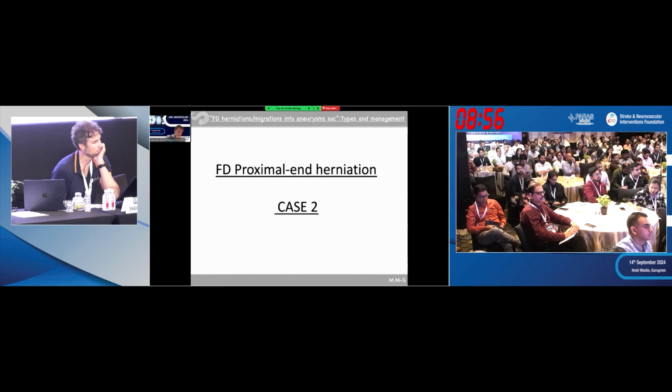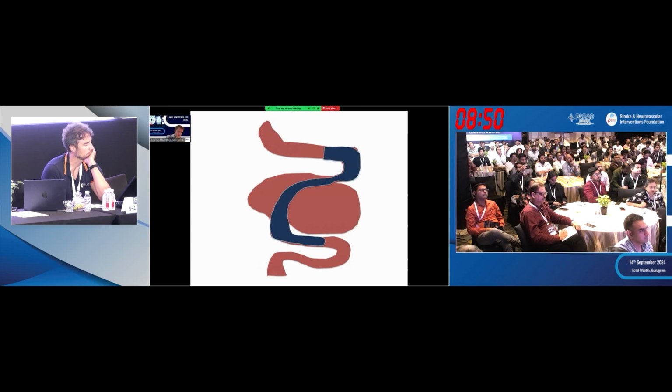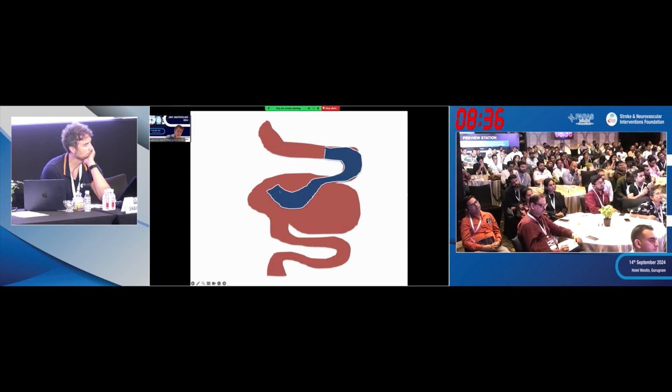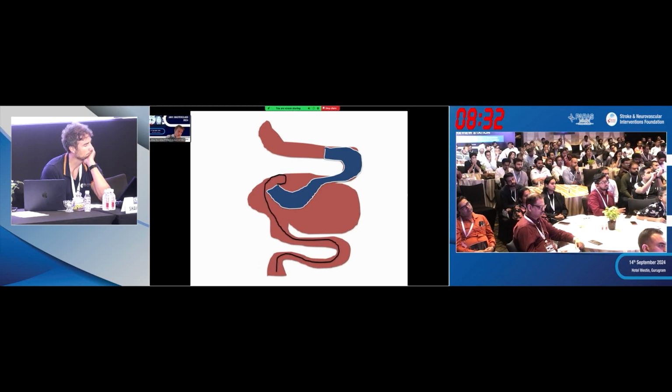Another case, proximal aneurysm. This is a different type of aneurysm. This is more dysplastic, more proximal, but may happen too. And in this particular case, the device was good, but it was really iatrogenic, because we tried to navigate through the stent to do an angioplasty, because distally they were not fully open, and during this we pushed the system inside. So this is iatrogenic, so we need to do exactly the same maneuver.